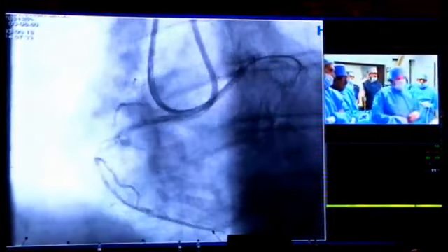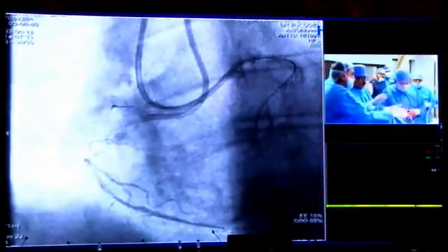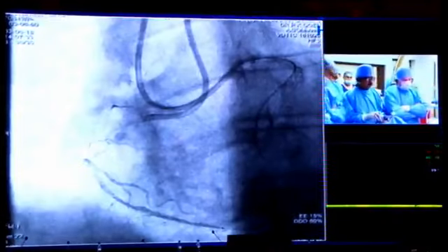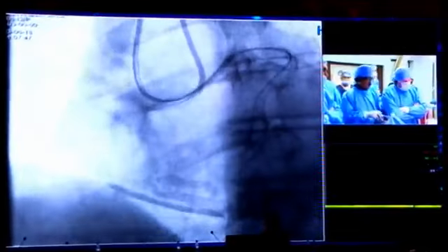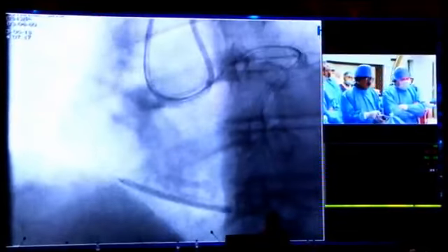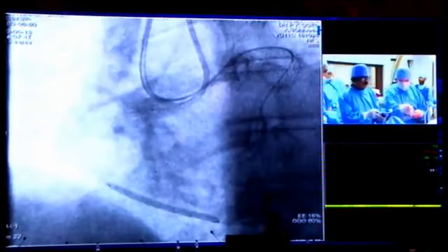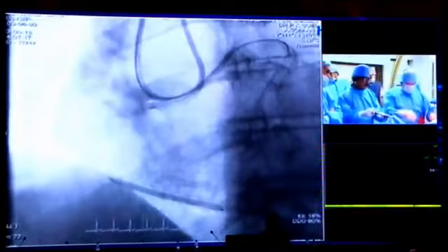Well, I think that's fine. Go up and then do a POT. Fluoro, please, 10, 12. That's the crux part. Okay, so we are up to 12 atmospheres.